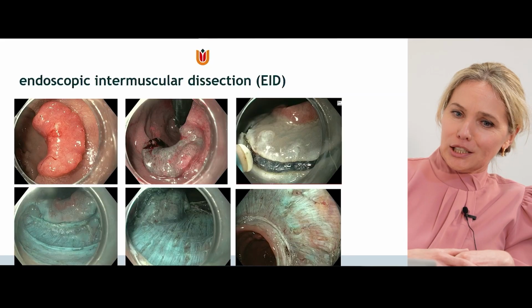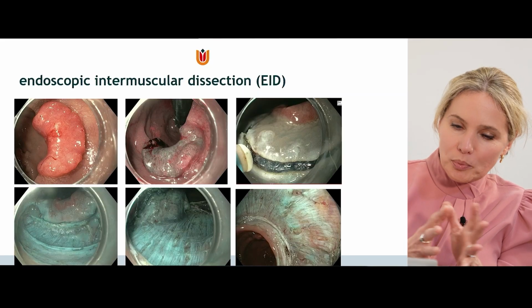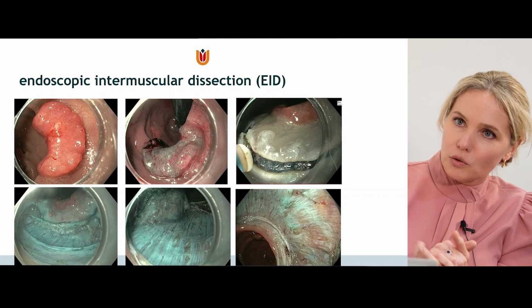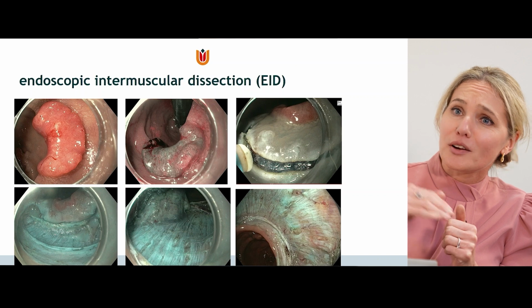Yeah. And we have a size limitation, and in our favorite organ, the rectum, we also have a hardness or pulling limitation. So now finally, we start the next step, your procedure, intermuscular dissection. Yes, the rectum is of course perfect for endoscopic intermuscular dissection, because the muscle layer in the rectum is so well developed. You can really differentiate and split the inner circular from the outer longitudinal. And there's a real clear plane, the intermuscular plane, which is not there if you move higher up.